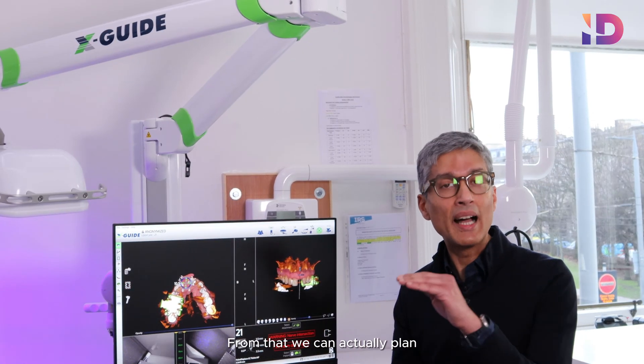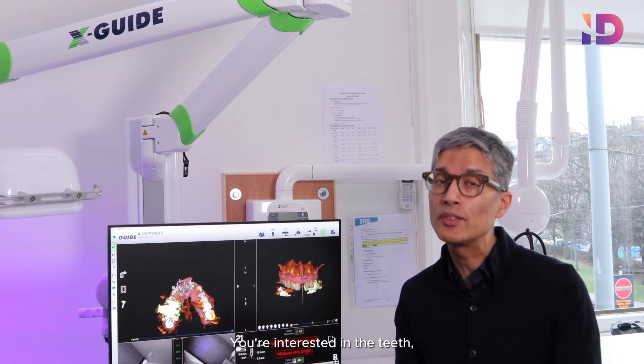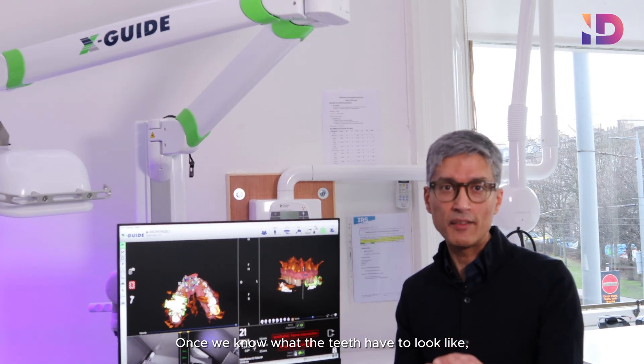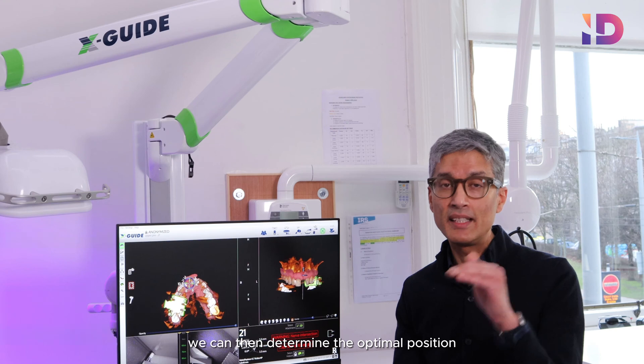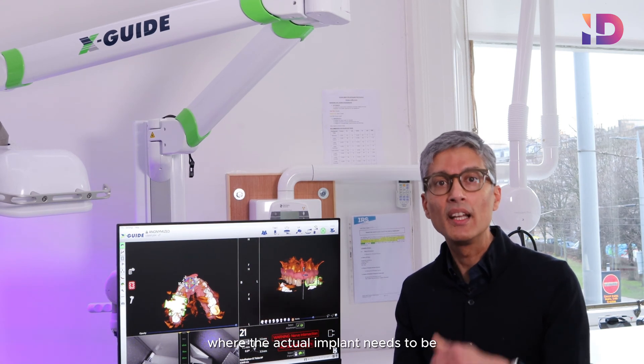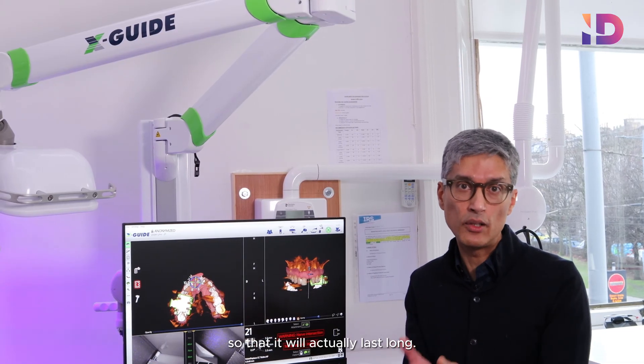From that we can plan exactly where the teeth have to be, because that's really the most important part — you're interested in the teeth, not what's actually underneath. Once we know what the teeth have to look like and how they're going to connect together, we can determine the optimal position where the actual implant needs to be in relation to that tooth, so we can get maximum support and it will actually last long.